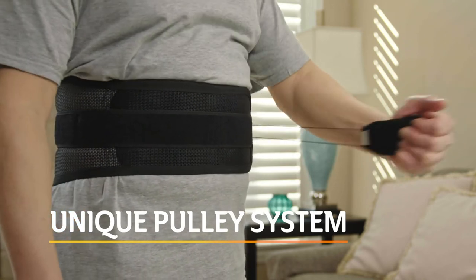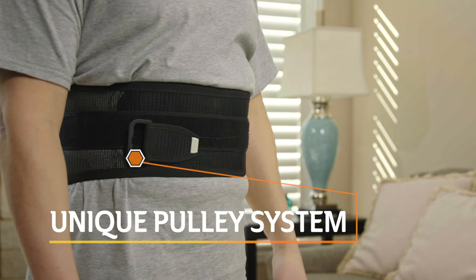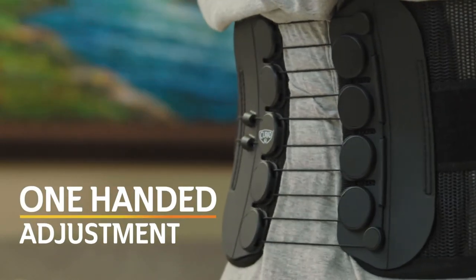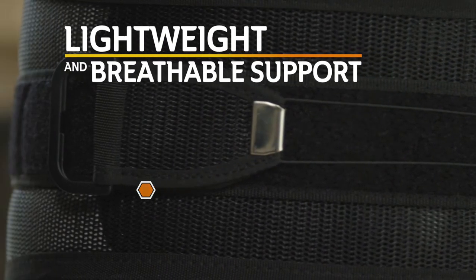This back support is designed with a unique one-handled pulley system that provides customized compression without twisting or turning. With one easy pull, the support can be adjusted to the desired compression. Made with breathable and lightweight materials for all-day comfort.